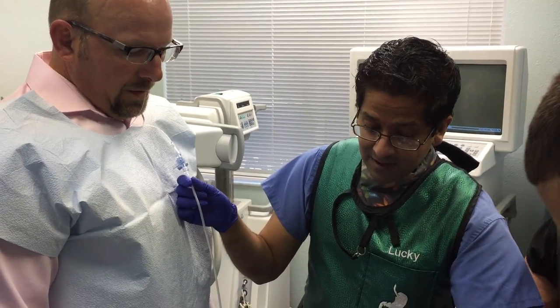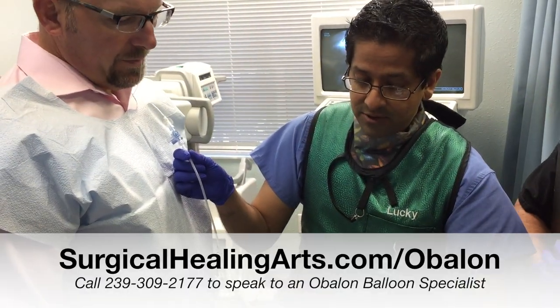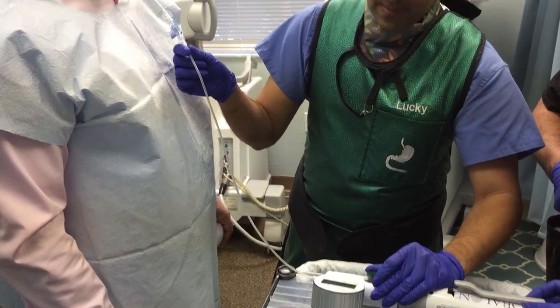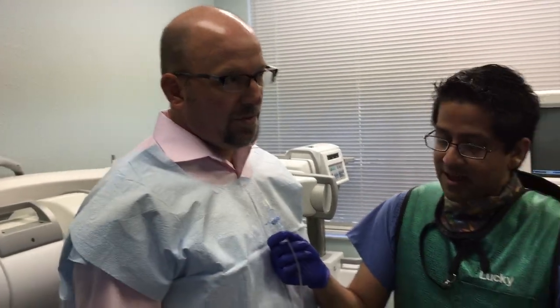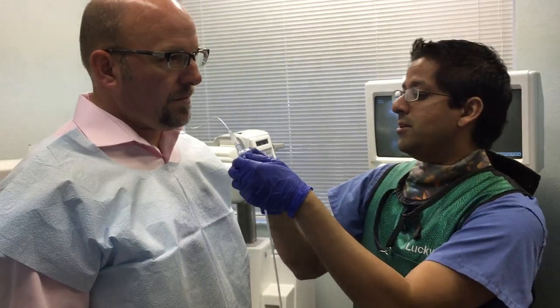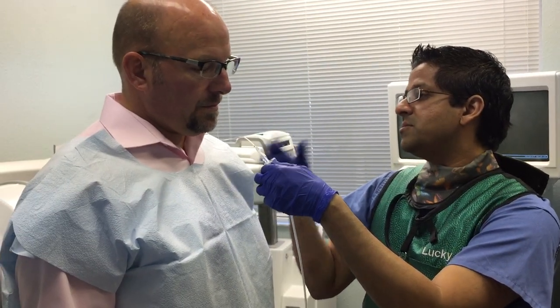Okay, ready. You let me know if there's a difference. Did you feel anything different? So we start at 153. I definitely feel fuller. 0.3 — we're good on that part. Alright, so Steven, I'm going to release. Okay, you're going to feel a little pressure — just the catheter moving.